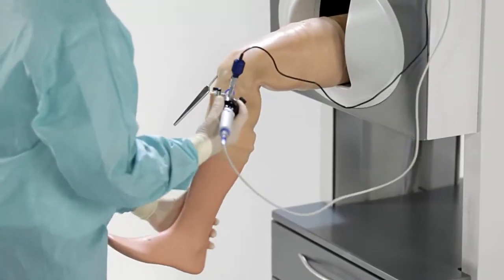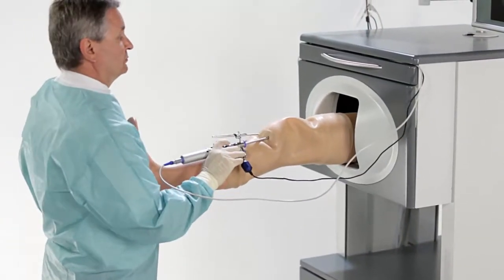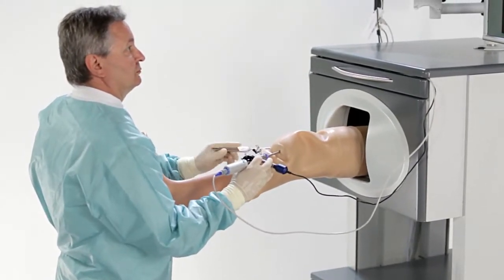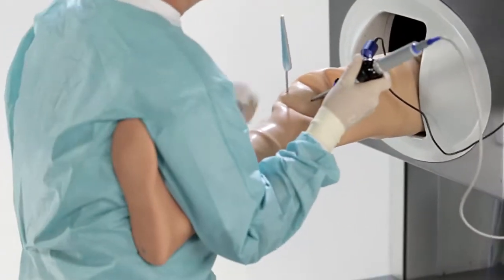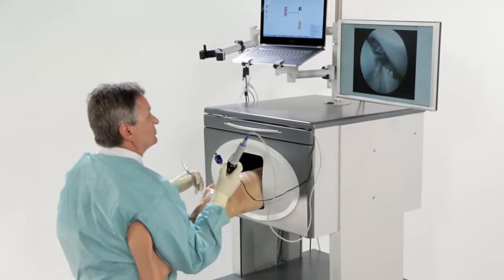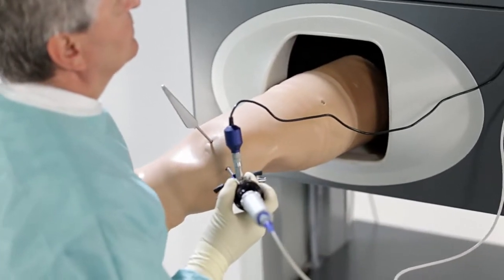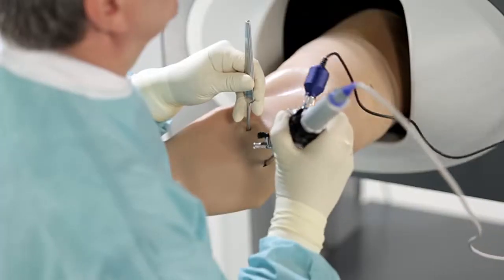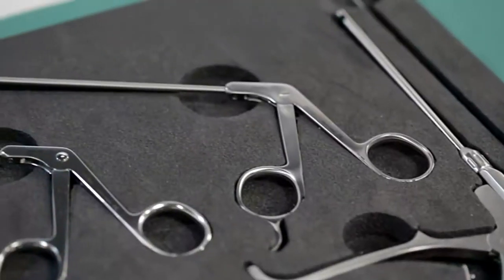Like the physical leg of a patient, the simulator leg is moved to the relevant positions: stretched out to access the kneecap and the top part of the joint, placed in the valgus position for an optimum view of the inside sections of the joint, and moved to the figure-of-four position for the space inside the knee on the outside.